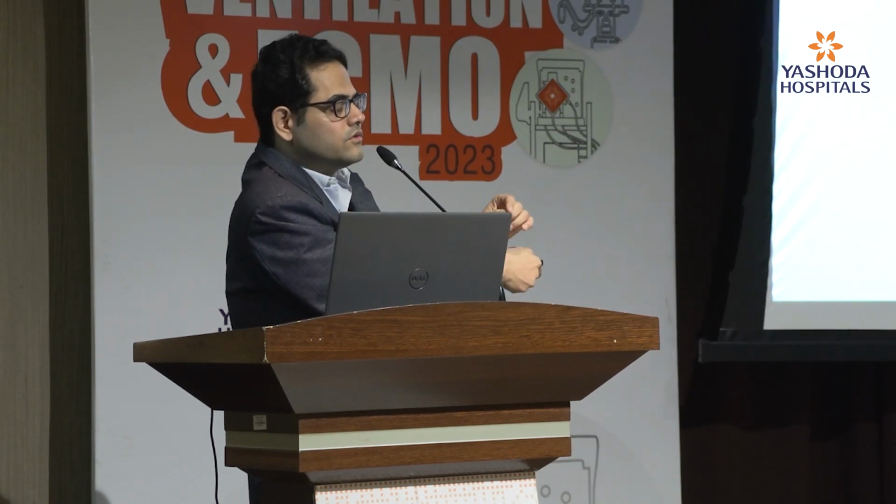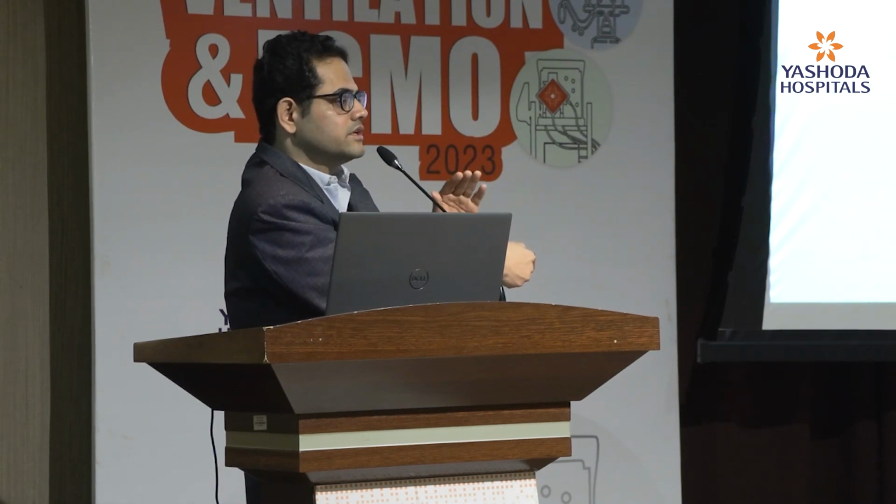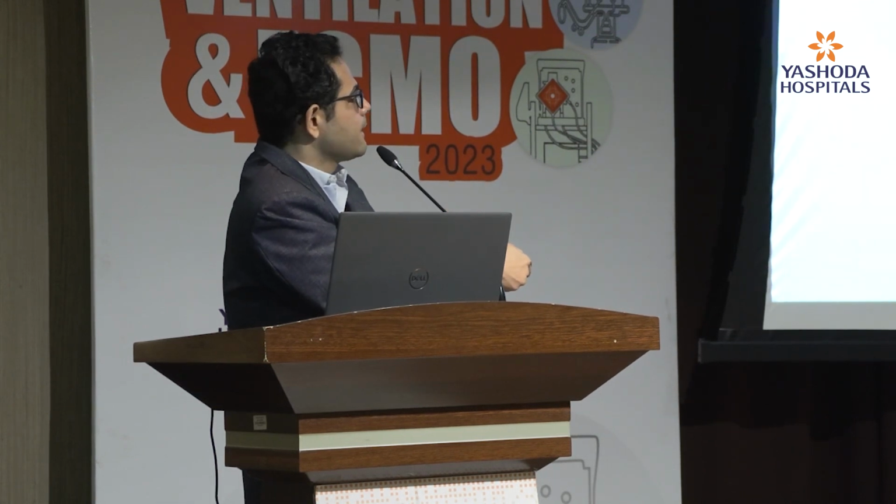So this is one of the modes of weaning. But they found that with this the work of breathing usually is going to increase, so it is not very commonly used. Still some people use SIMV.